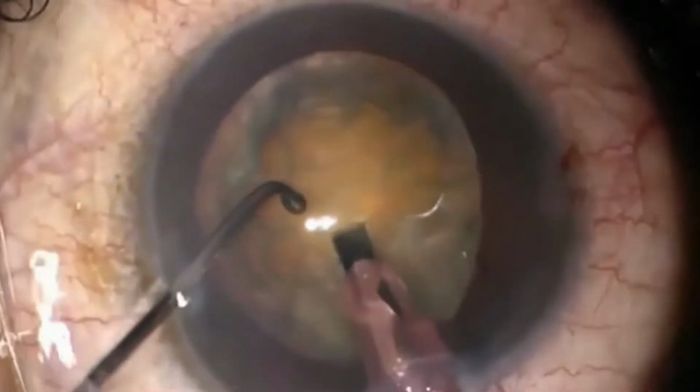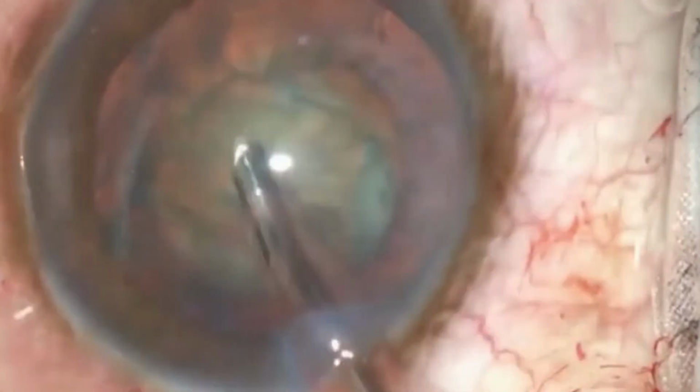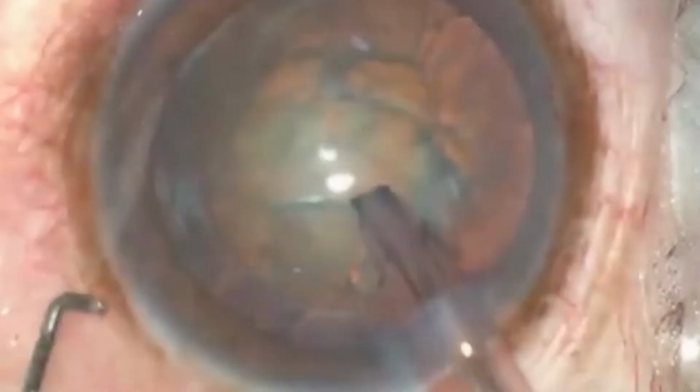The chopper is introduced through the paracentesis by turning it laterally, as the tip length measures 1.25 to 2.00 mm. Once the chopper is in the anterior chamber, it is placed in the capsular bag at the lens equator, opposite the main incision and in the same meridian.